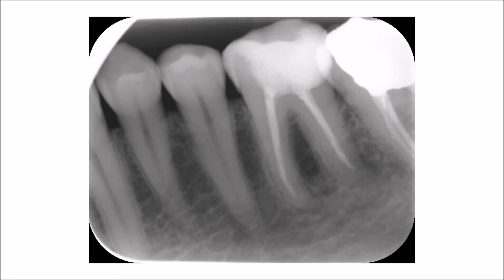Now shift to the distal of the tooth and measure again the distance between the line connecting the two cemento-enamel junctions and the line drawn across the alveolar crest margin. This again should be 1.5 millimeters. In all cases, those two lines should be parallel to each other.